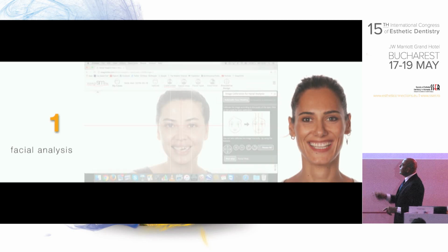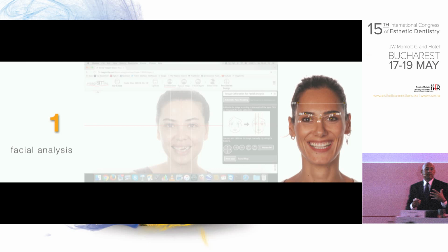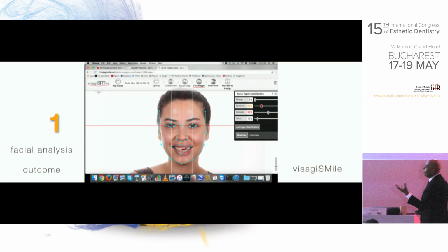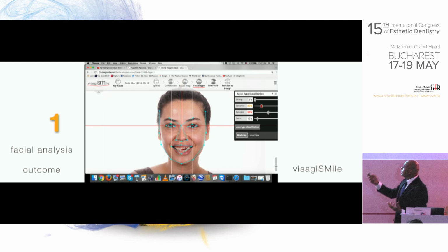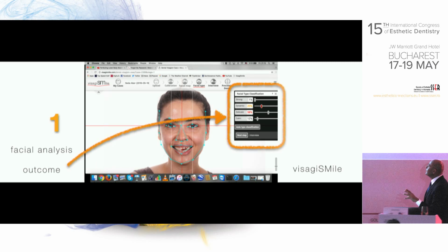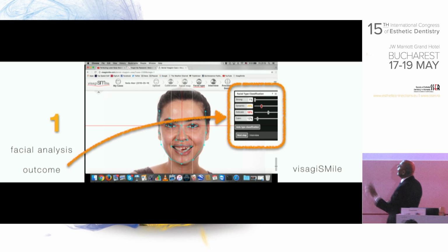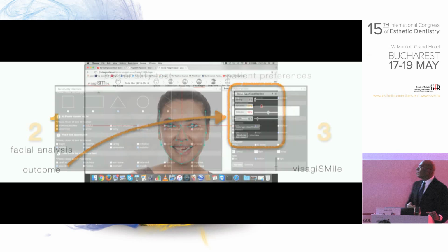And when it was doing this with the facial perception program, it was by itself automatically dictating these points in the face and then giving you the facial perception. So she is more like a delicate looking face. This is, in this calculation, 58%, and the dynamic part is the secondary. So when we look at the face like this, we see a mixture of mainly delicate and dynamic.